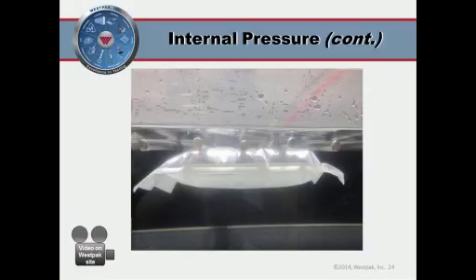The distinction with dye penetration is that it only looks for channel leaks. So it only looks for seal channel leaks. So dye penetration is used mainly for seal validation when you're trying to see if there's any leak across the seal width. Bubble testing is known to our customers as being the sterile barrier testing because you look at the whole package, the seals, the pouch, the material, everything else. Herb, would you like to add something?